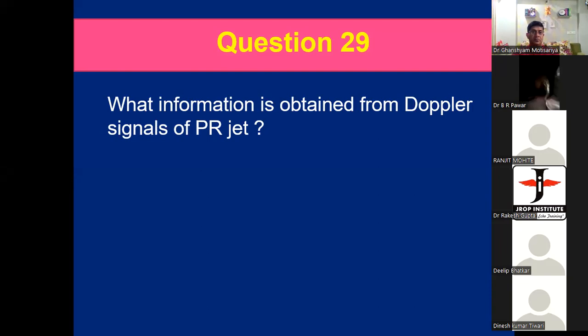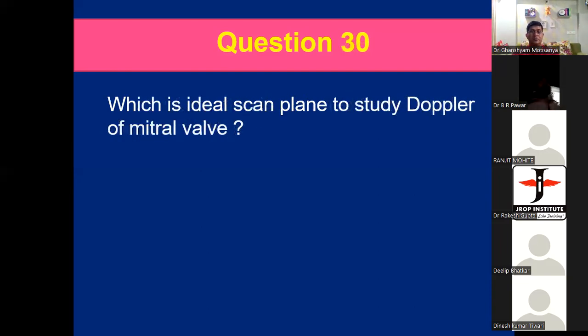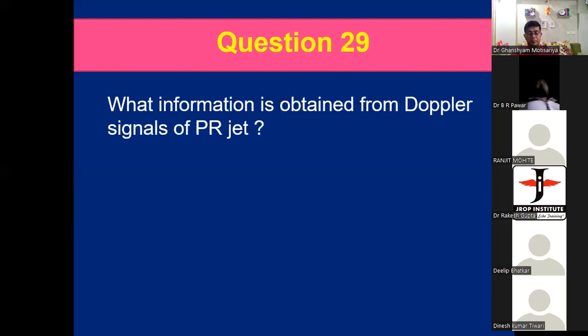It may be functional PR secondary to pulmonary hypertension. What is the significance of PR jet signals? Read, Dinesh. You have to read it definitely. Okay, sir. Sorry.